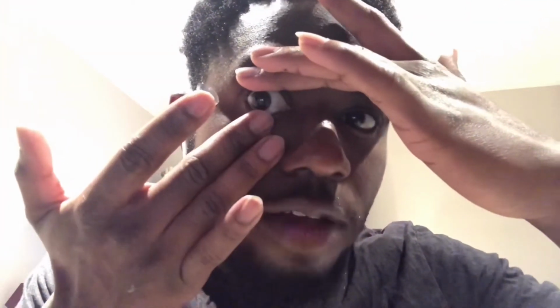Okay, now what I want you to do is, with your middle finger, lift your upper eyelid, and with your other middle finger, pull down the lower one. Now, as you put in the lens, tilt it a bit. Twist it a bit in your eye, and then close your eyes. Look left, right, while your eyes are closed. Okay, that's it. Number one is in.